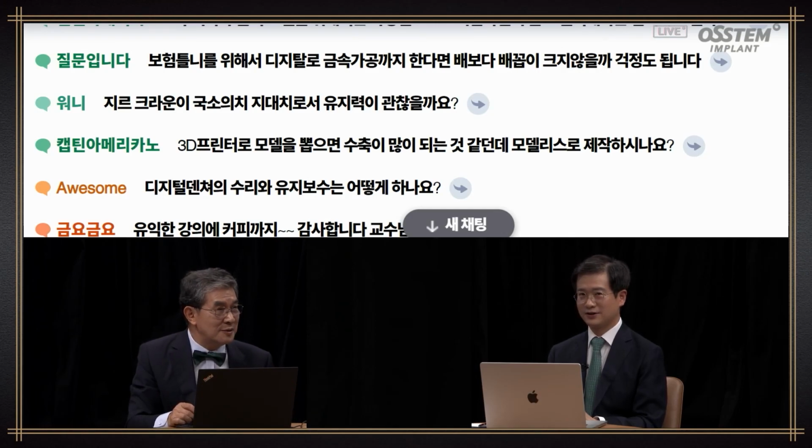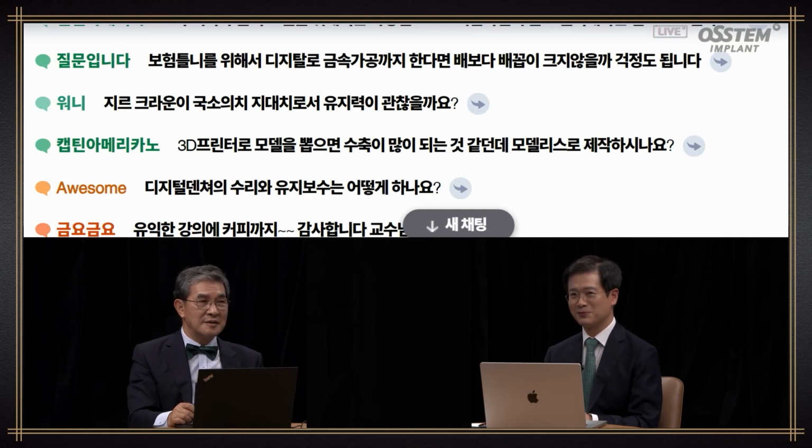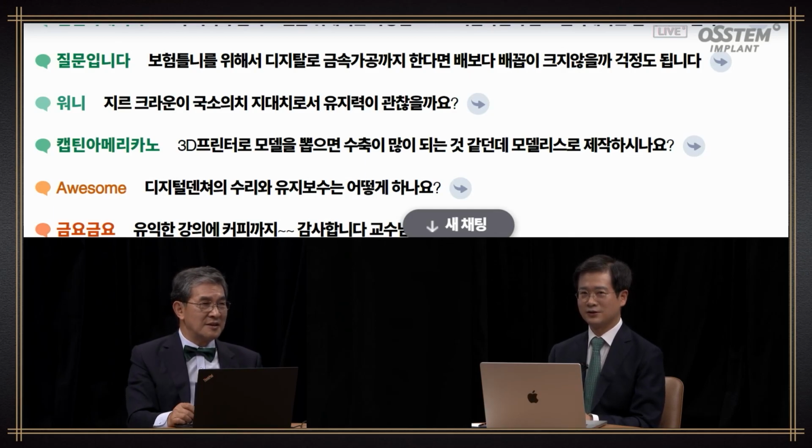Well, digital denture is not really done for dentures covered by health insurance. But I talked about the metal frame because I was talking about how I got started. Once it becomes a routine and widely used surgical technique, I think the cost will go down. Yes, you can mill the wax.